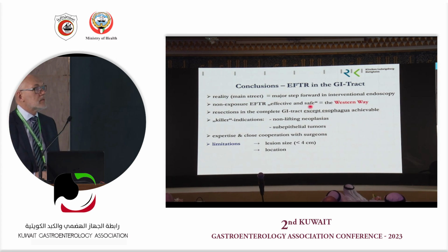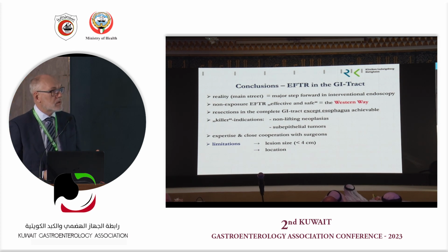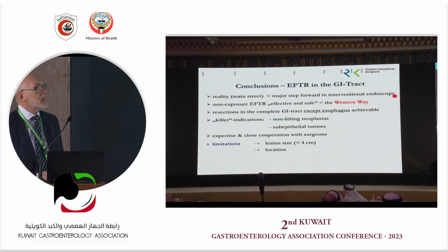I would say this is the Western way. In Southeast Asia, especially in China, they're much more aggressive, opening the cavity of the stomach. And I think resections can be done in the whole GI tract except the esophagus, with these devices, and the killer indication is non-lifting neoplasias and subepithelial tumors.